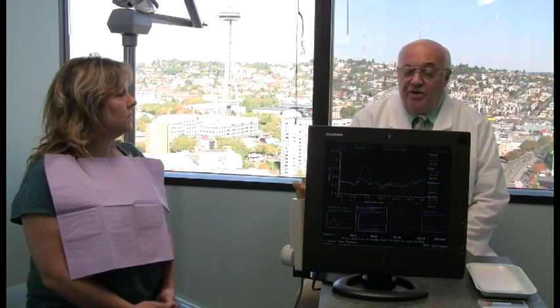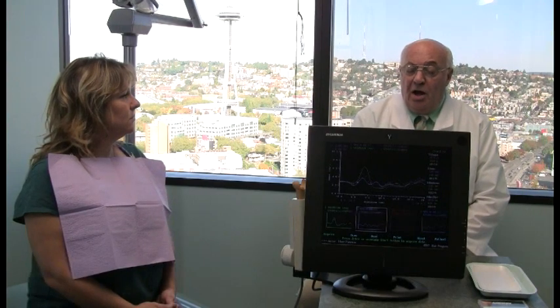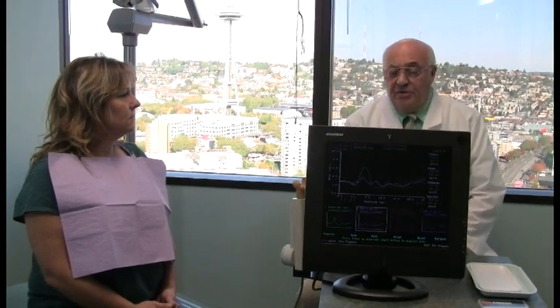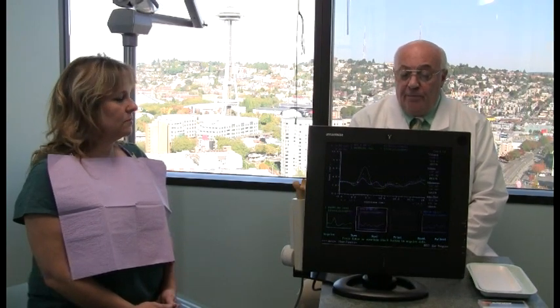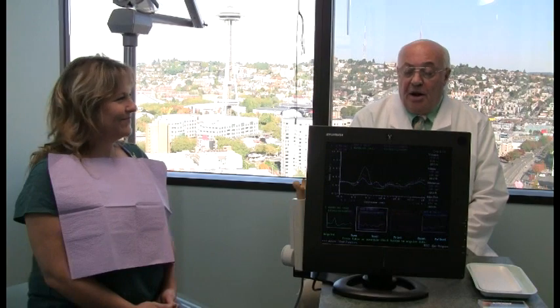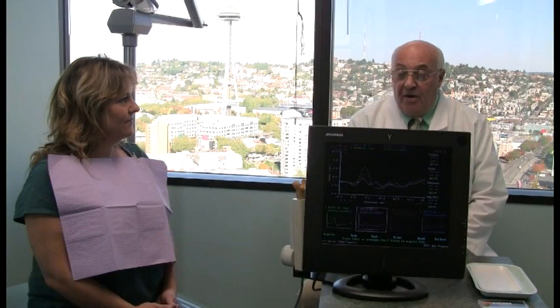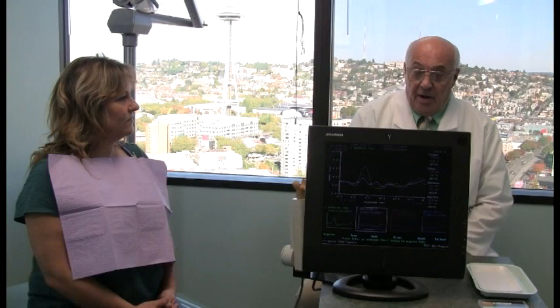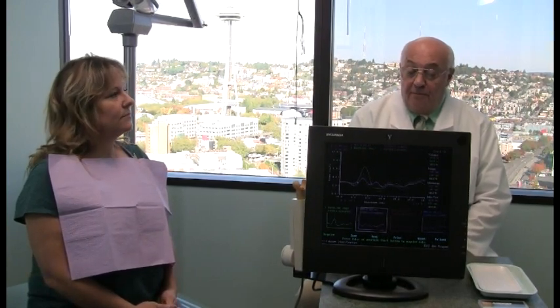those for you, because we started with an end-to-end 6 vertical, and on a scale of 1 to 5, where 3 is her natural airway, below 3 is of course less, and above 3 is an improvement. And at E6 she got a 4, and it was comfortable. At 2-6 she got a 5, and that was comfortable. At 3-6, her airway was a 5 and less comfortable. At 4-6, it went to a 4 again, and also was less comfortable. And you'll notice that that's farther anterior.